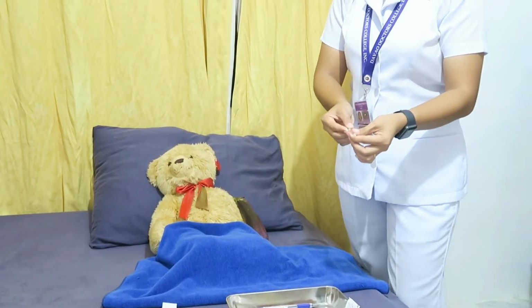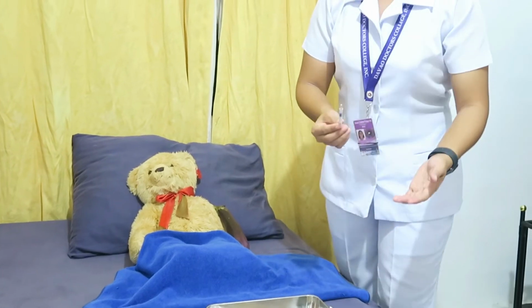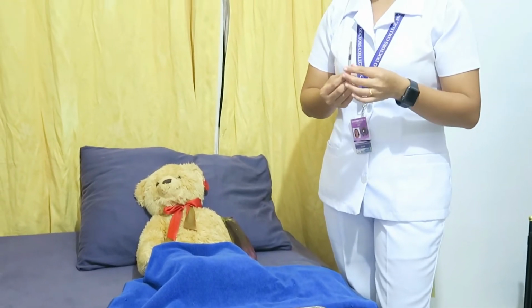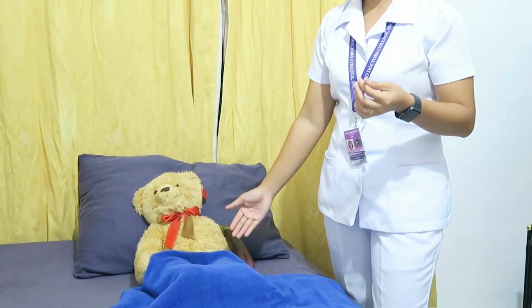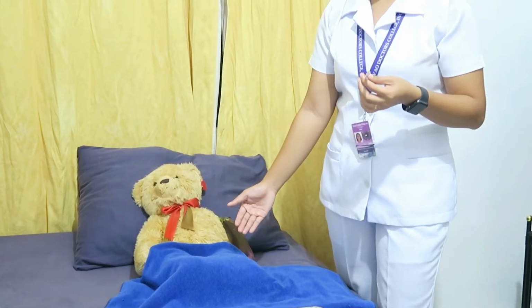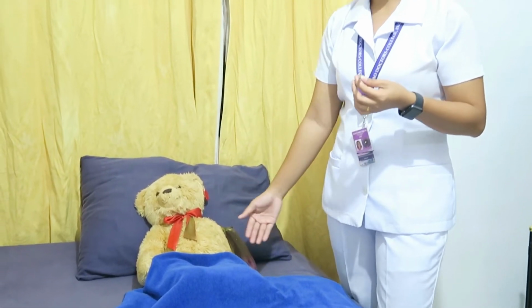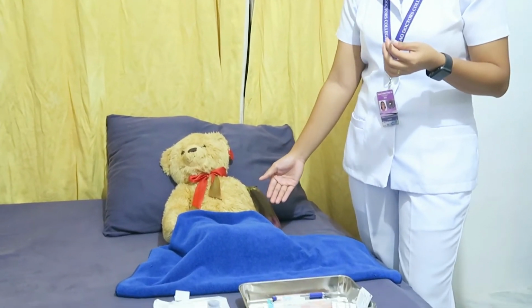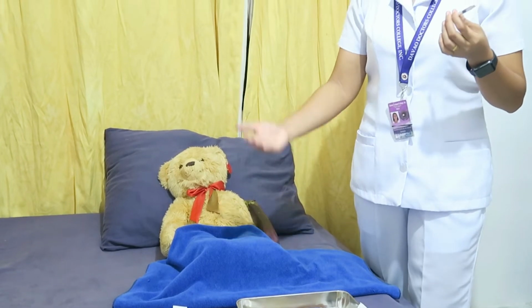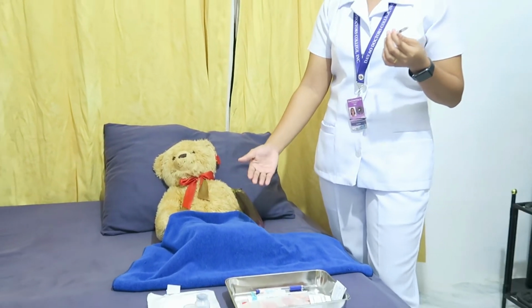So this, remove, and then while waiting for the antiseptic to dry, the site is already dry, so expel any air bubbles from the syringe. Small bubbles that adhere to the plunger are of no consequence. The rationale for this is that a small amount of air will not harm tissue.